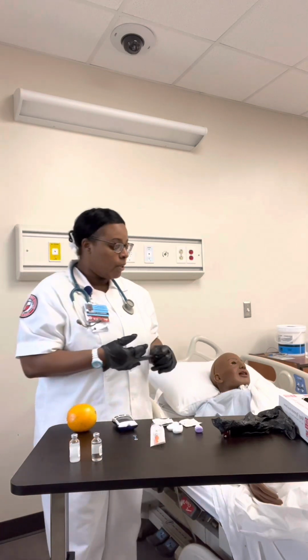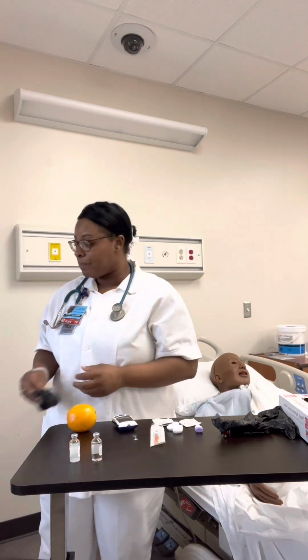I would then turn off the glucometer, disinfect it. I will explain the results to the client, remove my gloves, perform hand hygiene, and document.